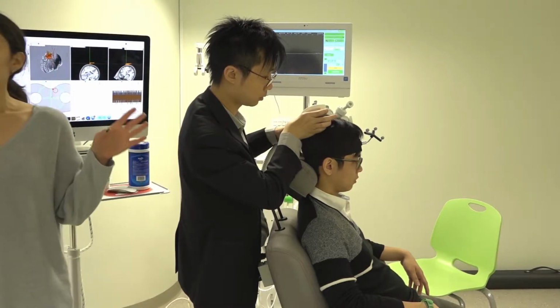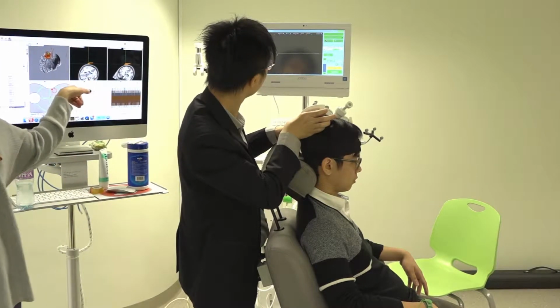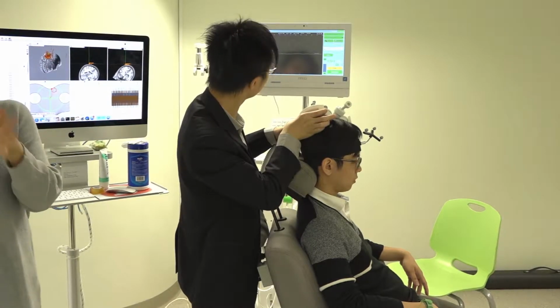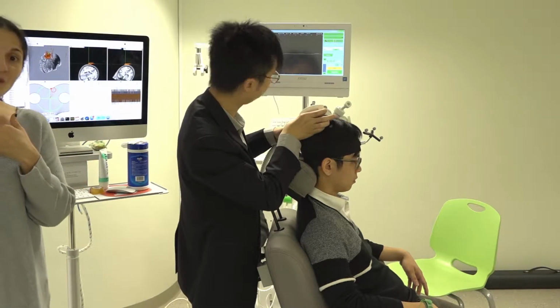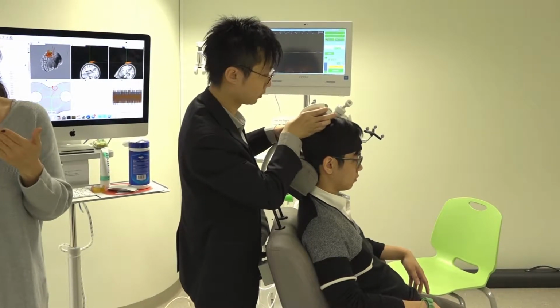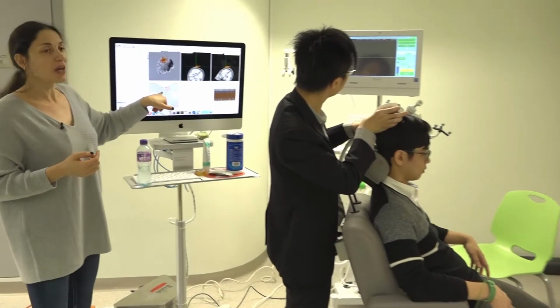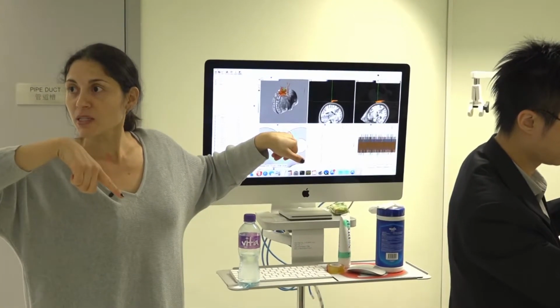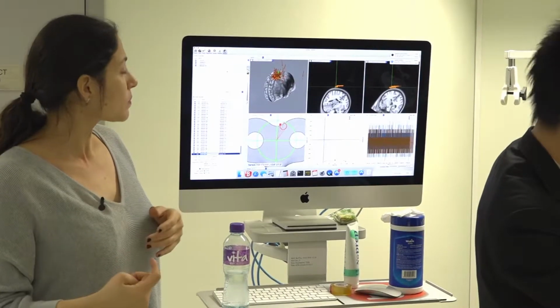Notice something here. He got a spot where he could stimulate, which is very different, as you can see, to mine. So it's not advisable to use different experimenters in one experiment, because the way you hold the coil is different to the way I hold the coil, and where I find my spot is different to where you find the spot. It shouldn't be like this, but it is like this. So you can see here, he's a little bit far from the area where I am, and in the area where I am, I can actually generate higher MEPs, right? So you need to practice, practice, practice.